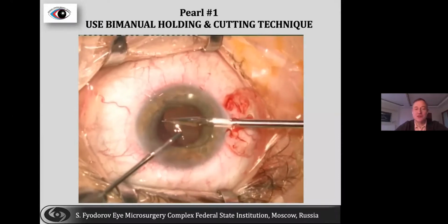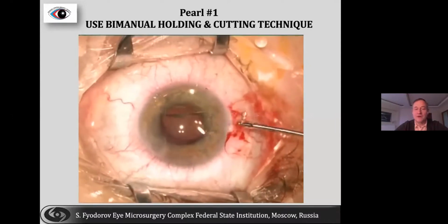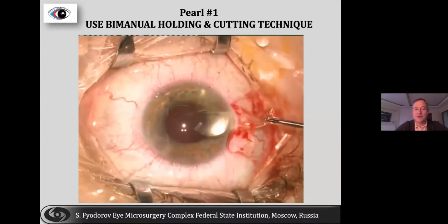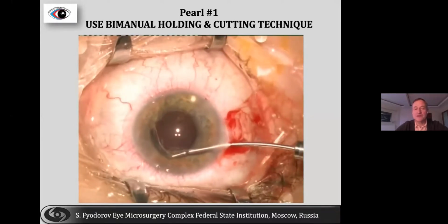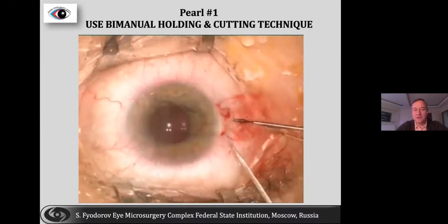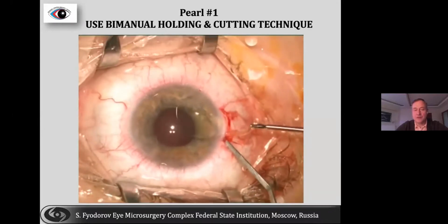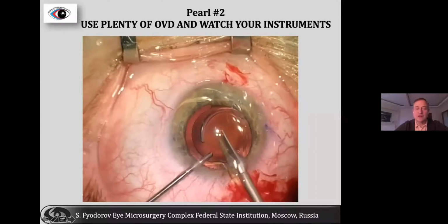And as shown here, the proper intraocular scissors are these Packard-Chang scissors made by MST. I have no financial interest in that, and I love these scissors because they help me very much in solving these problems. So this is another clinical case.